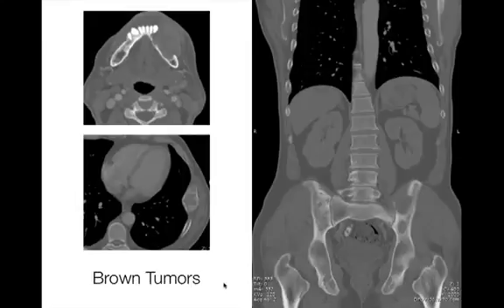But maybe if you saw that mediastinal mass and you were able to think that, hey, could this be a parathyroid adenoma and causing all these brown tumors, which is probably a bit of a leap because probably not your first thought. If you see a mediastinal mass and multiple bone lesions, you're going to think some kind of scary malignancy in Mets, but nonetheless, that's what this turned out to be.